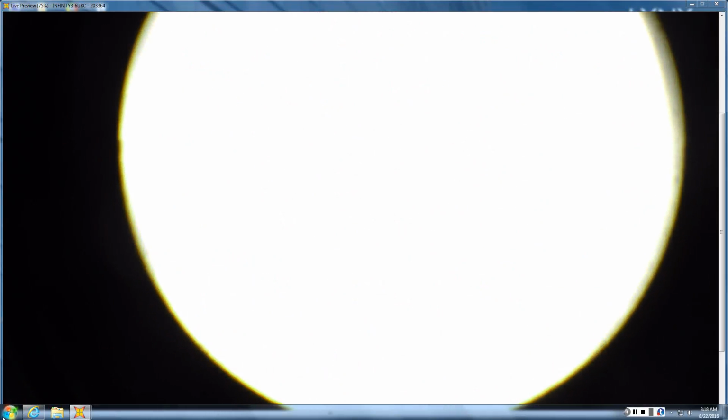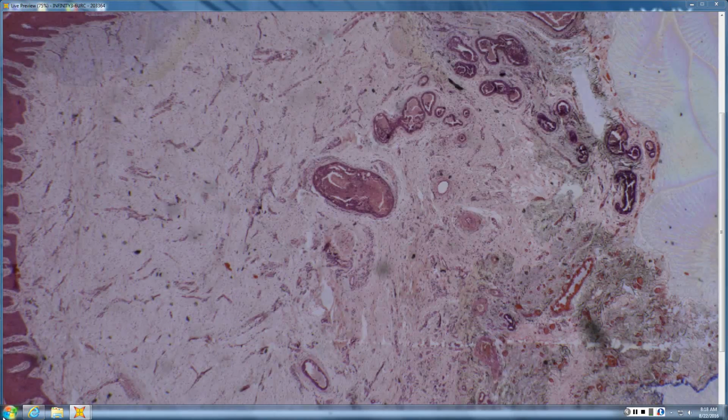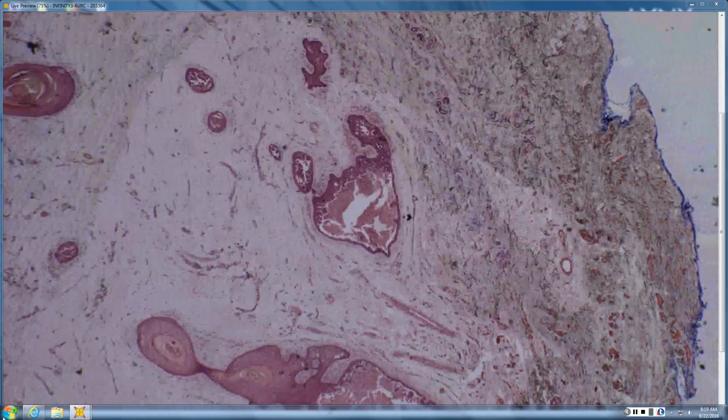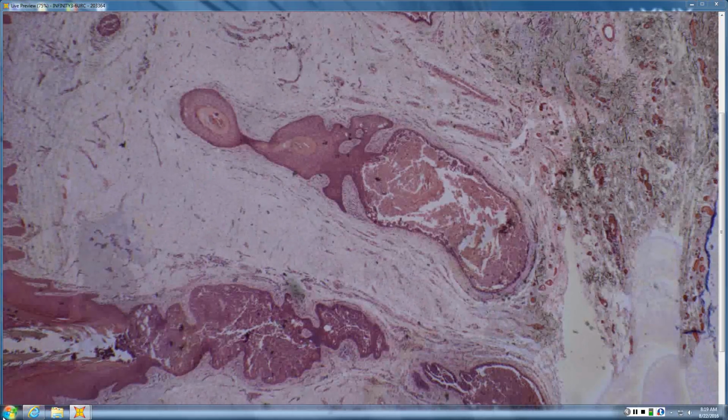In path residents, these come up a lot on test questions, because you can look at them too closely and the nuclei look big and kind of atypical, and so they want you to be able to recognize that it's benign versus calling it a malignant breast tumor, because that's a huge change in treatment for that patient. Yeah. Thank you.